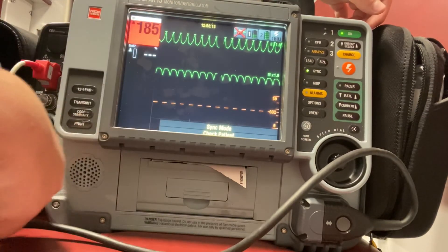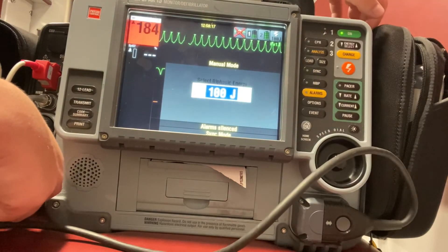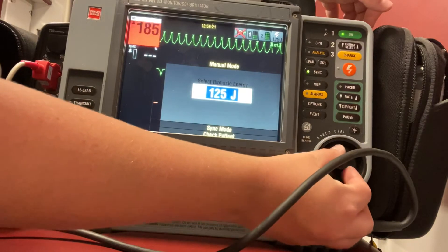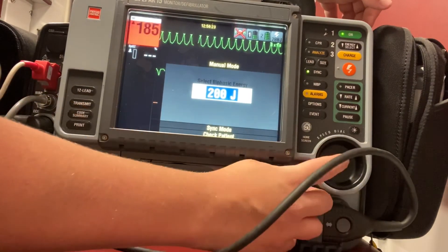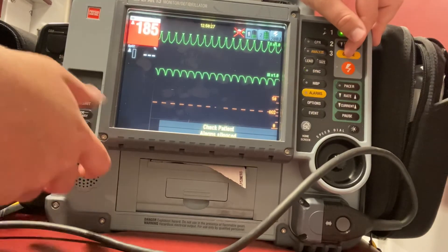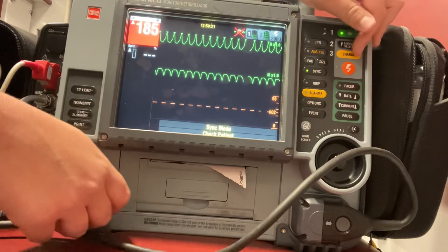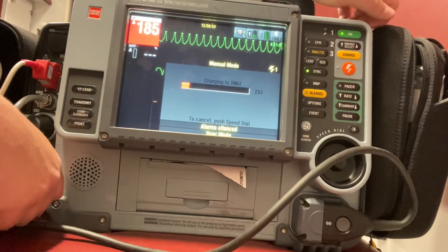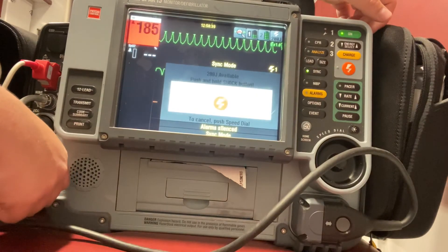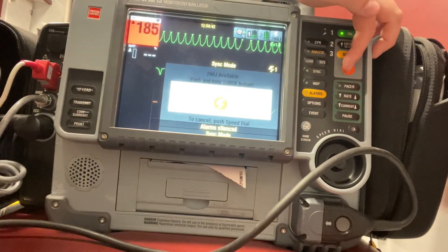I can see I have my arrows at the top of my QRS complexes after re-syncing. Now I go to energy select — it's still at whatever I set it last time — so I do want to up that to 200 joules and select that. I can go ahead and make sure my patient's aware of the procedure. We're also considering sedation. I charge, make sure everyone's clear of my patient, no one's touching the patient — I'm clear, you're clear — and we deliver that shock.